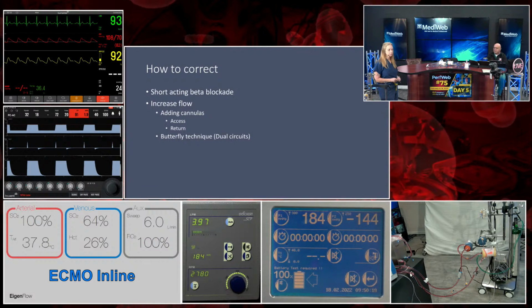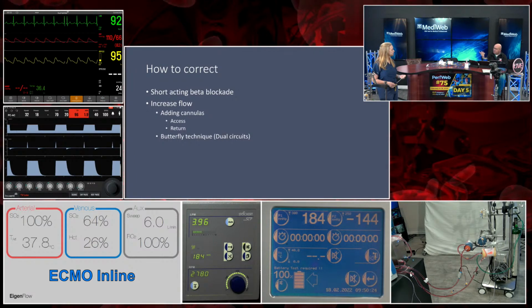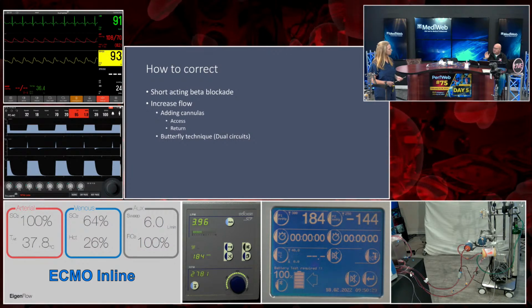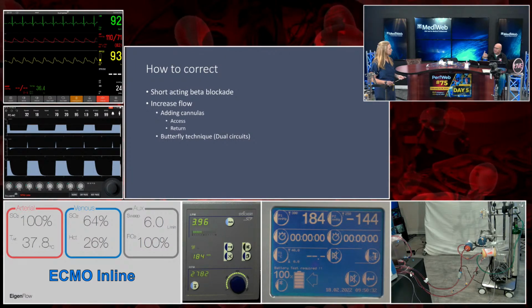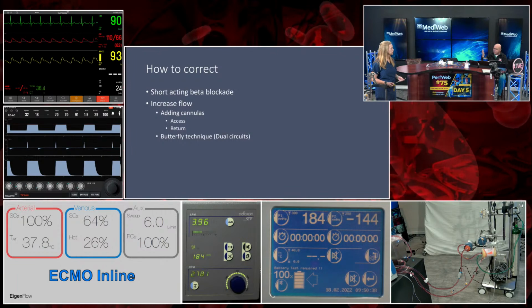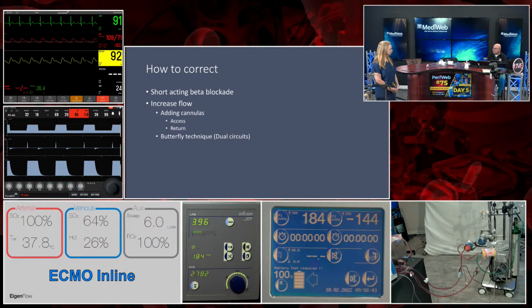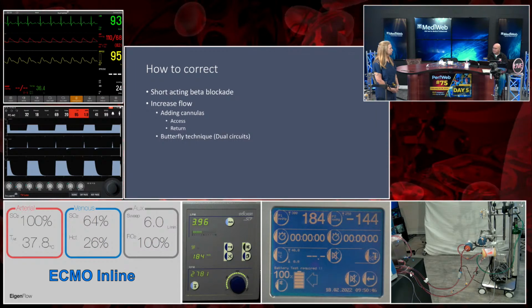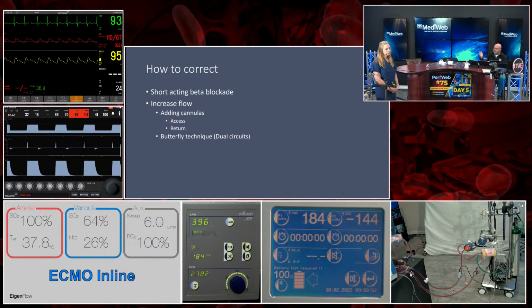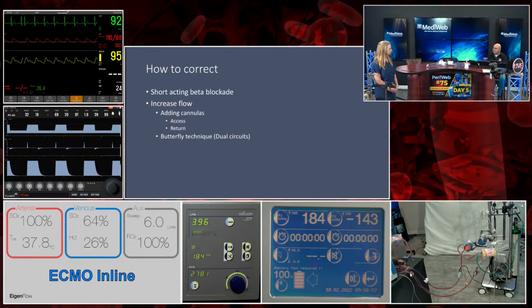One of the things I do want to point out is when you look at adding CRRT to this, and we're going to do that on, I believe, Tuesday of next week, where I'm going to put it in. The CRRT machine is designed to operate in a venous vein, right? Femoral vein, IJ, right atrium, whatever. And those pressures are usually pretty stable, somewhere between 5, unless the patient is completely empty, up to about 20 if the patient is really sick and volume overloaded, heart failure, etc. But let's just say 10 to 15 in that range.